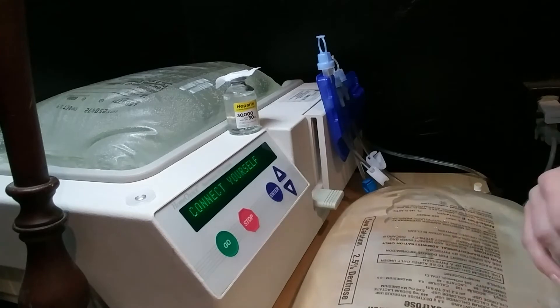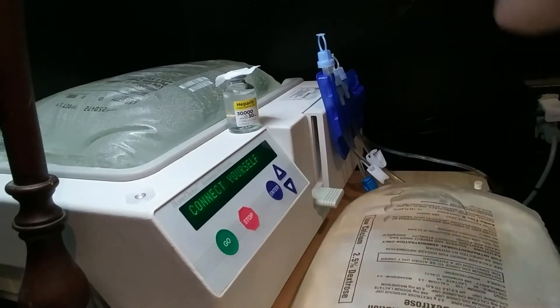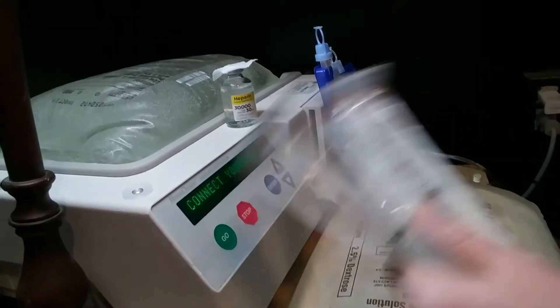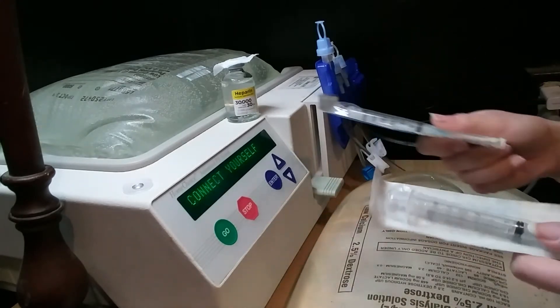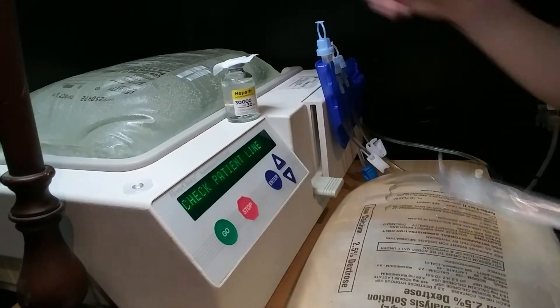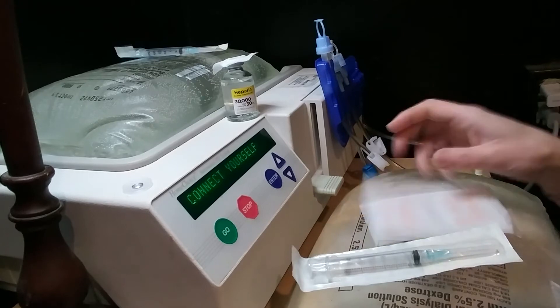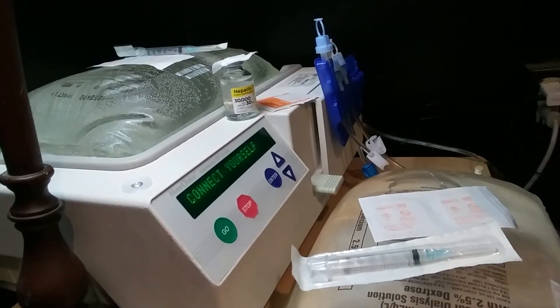Short recap: machine is set up, bags are ready to go, and we have our heparin being prepared. I have two unopened unused syringes for the heparin — I'm going to use one for each bag. I'm also going to use two alcohol wipes for each bag and one more alcohol wipe for the heparin.